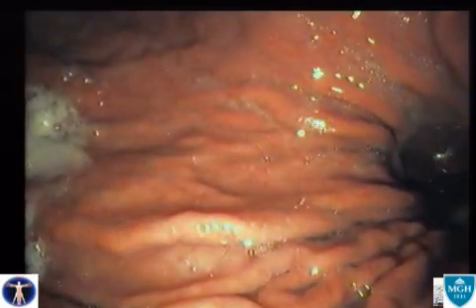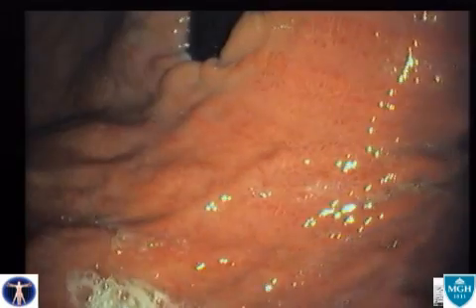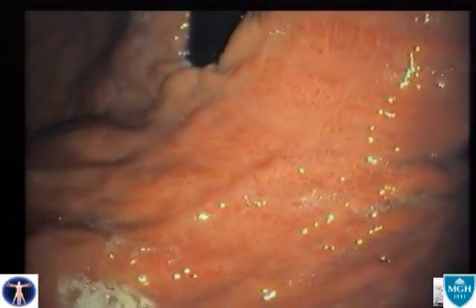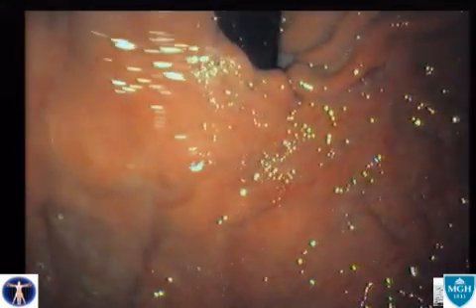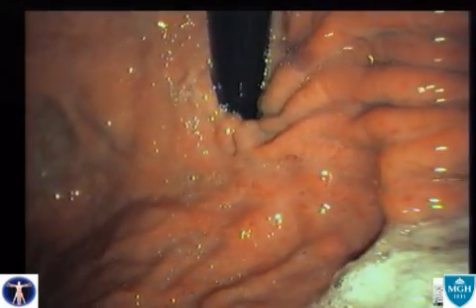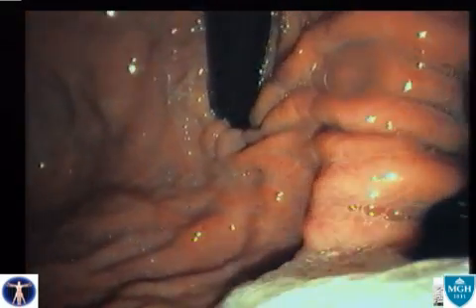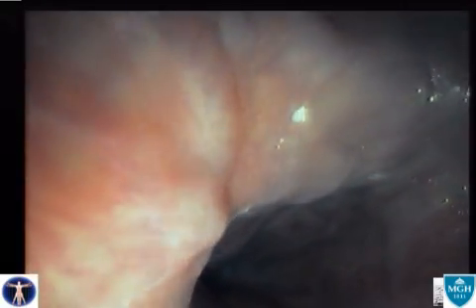This fine reticular, lace-like pattern bordering the edematous gastric projections may represent engorged lymph within the epithelium. The severity of this lesion and its associated outcome, chronic gastrointestinal bleeding, has been correlated with the degree of portal hypertension. While increased gastric blood flow has been documented in patients with portal hypertensive gastropathy, it is not clear if increased venous pressure or passive congestion from portal hypertension has a true etiologic role.